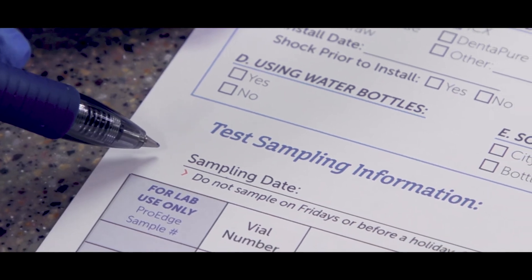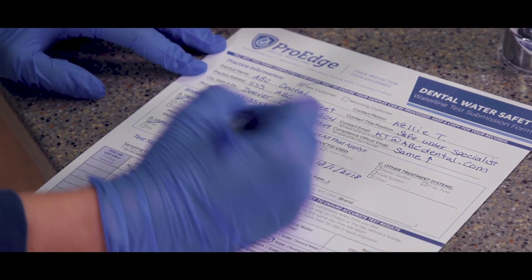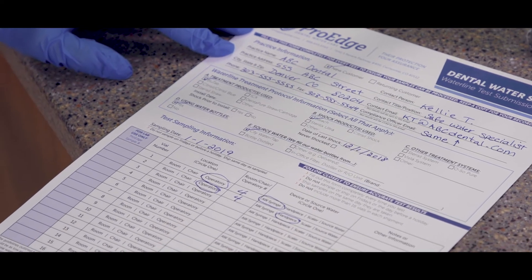So the dental pro has taken their water samples — what do they do next? Note the date that you took your samples on the submission form and fill out all the other sections of the form completely. Yes, all of it. It doesn't really take that long and it makes the whole process much smoother for our lab team.